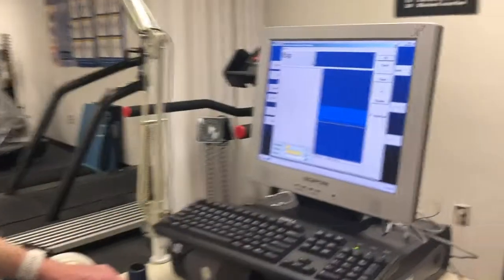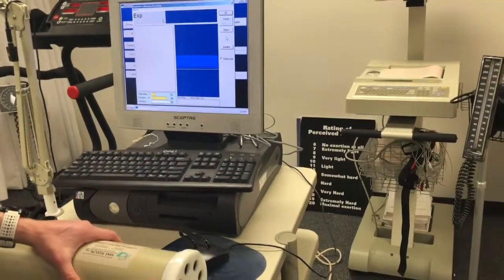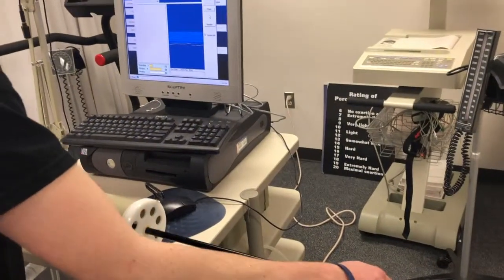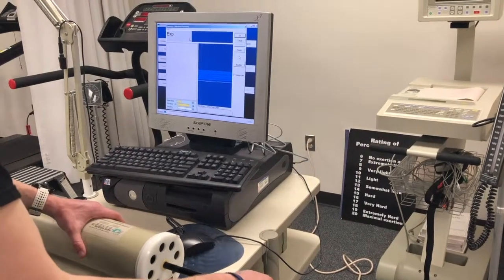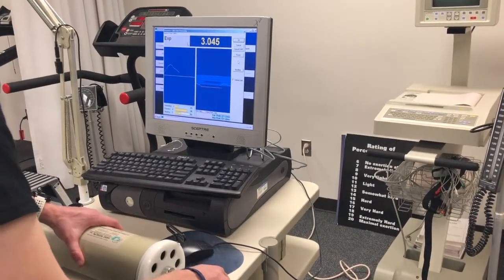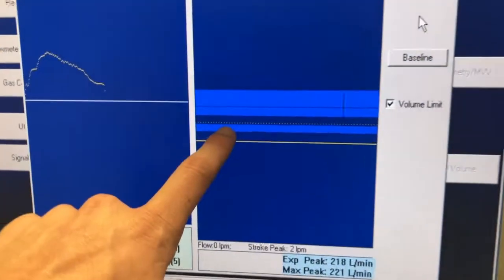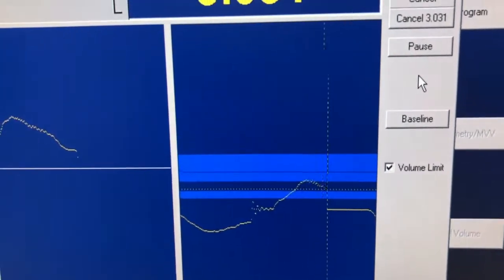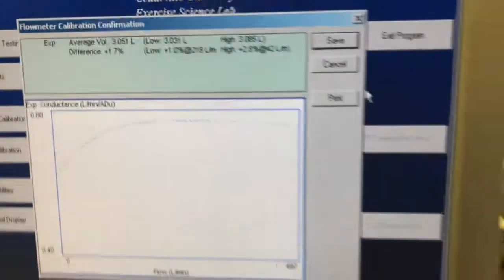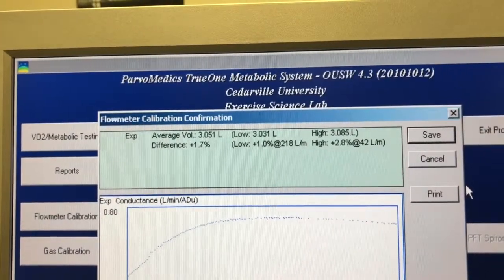After you've done the four flushes you're going to do five strokes. These are all at different speeds to get the pneumotach calibrated to different flows. The first one is going to be slow then it gets faster. You can see this little dotted line — that's the line you're trying to hit with each stroke. You're looking here for this difference value; you want that to be less than five percent. As you can see it's 1.7, so we're in a good range and we can go ahead and hit save.